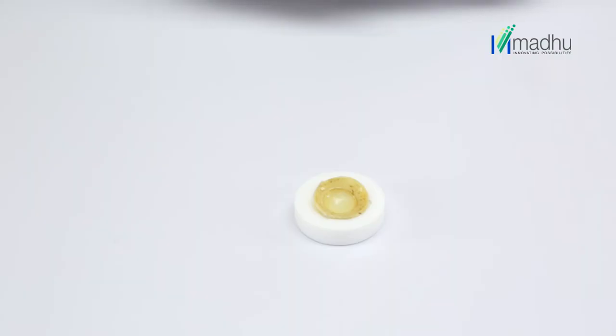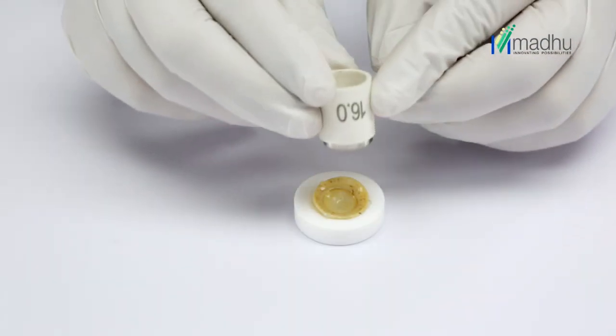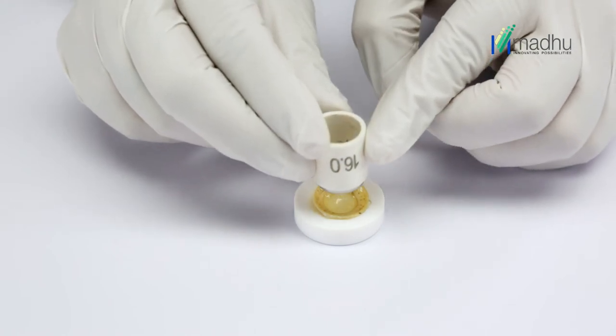Centre the donor cornea with a fine tooth forceps. Centre the trephine over the cornea and gently place the trephine blade on the corneal surface.